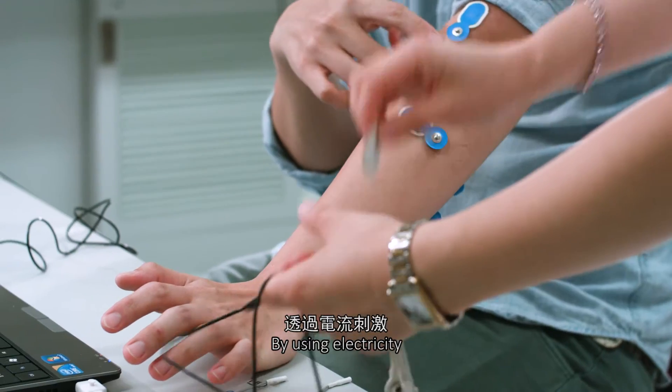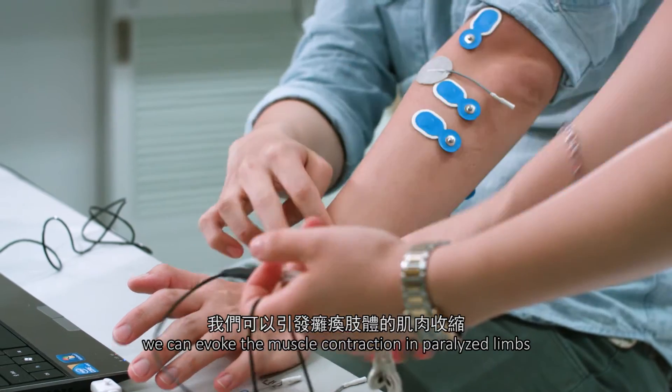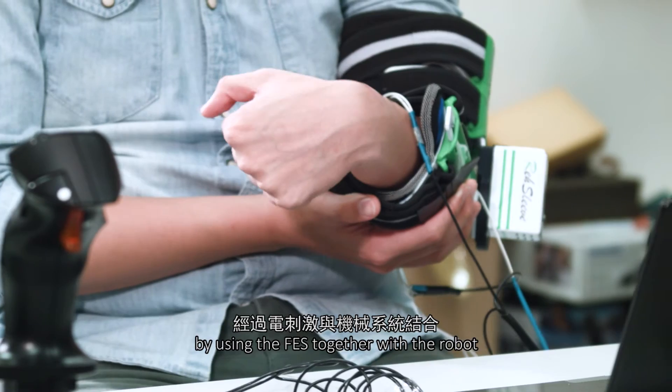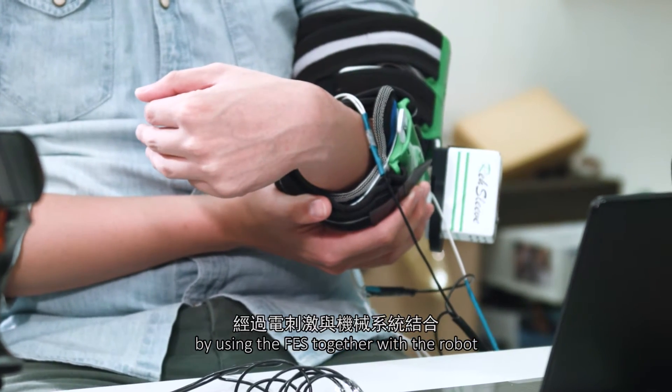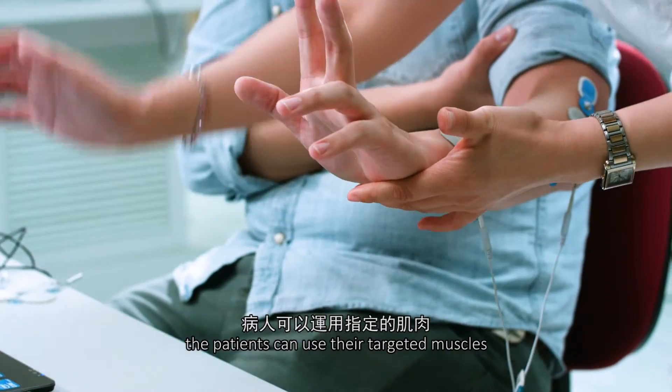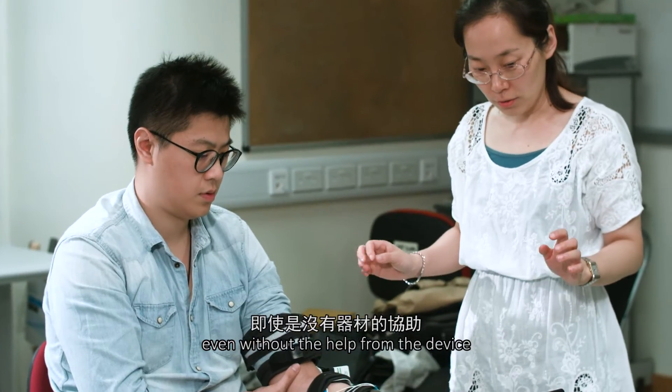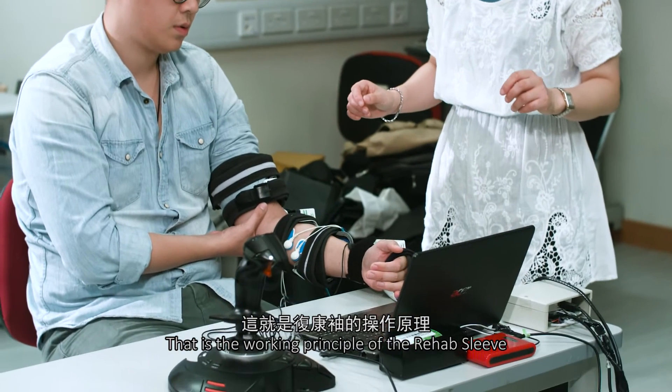By using electrical stimulation, we can evoke muscle contractions in paralyzed limbs. We found that by using functional electrical stimulation together with the robot, the patient can use their target muscles to achieve their target movements even without help from the device. That is our working principle for rehabilitation.